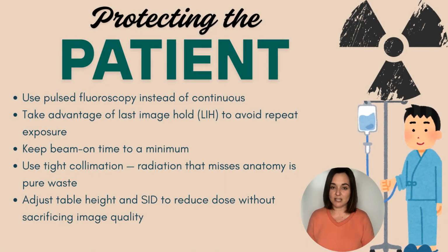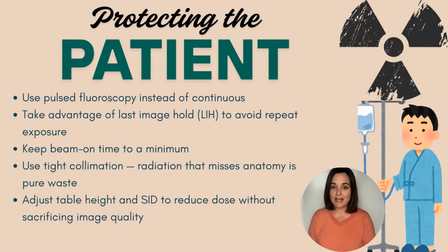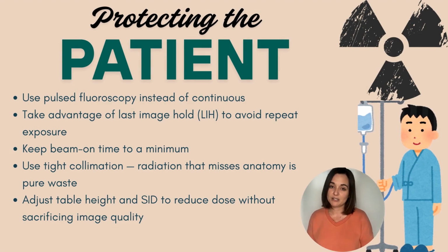Protecting the patient. Use pulsed fluoroscopy instead of continuous. Take advantage of last image hold to avoid repeat exposure. Keep the beam on time to a minimum. Use tight collimation. Radiation that misses anatomy is pure waste. Adjust table height and SID to reduce dose without sacrificing image quality. Here's a bonus tip: ask the radiologist to narrate findings while viewing the LIH instead of fluoroing nonstop.